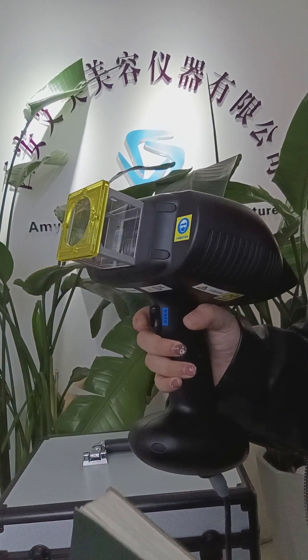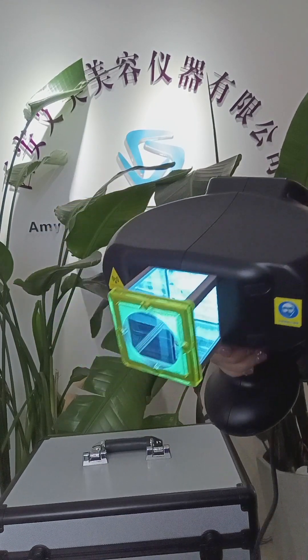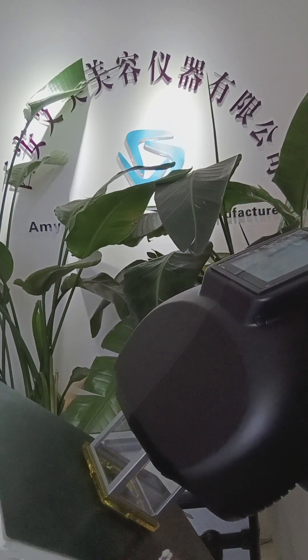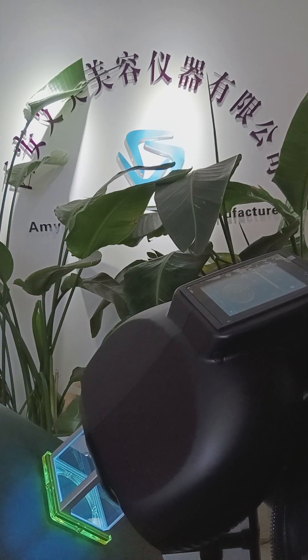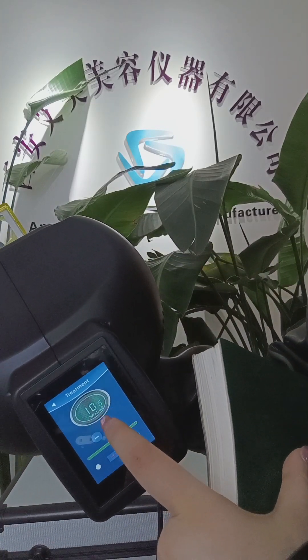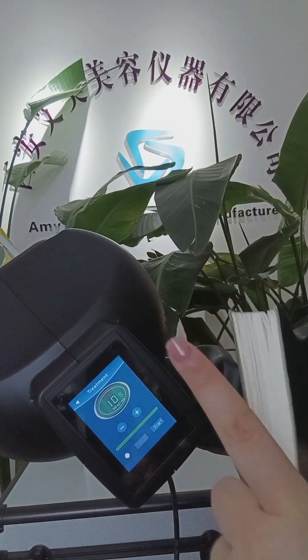You need to set this button and continue. You can see the light. Put this area on the body part and wait until the timer counts down to zero — one treatment is over.